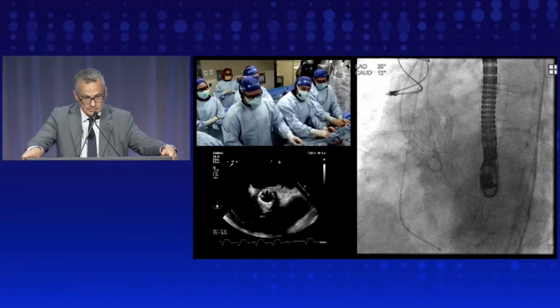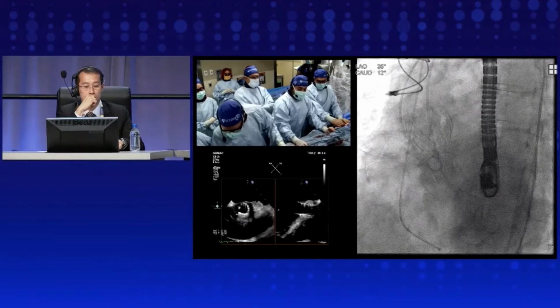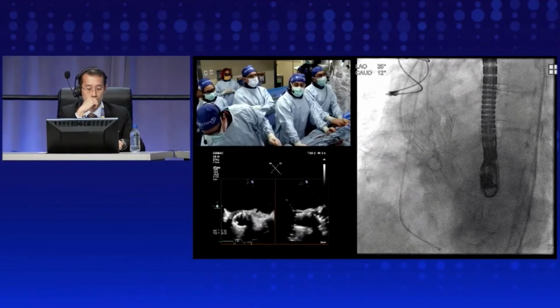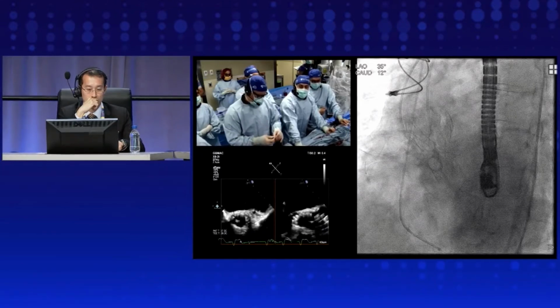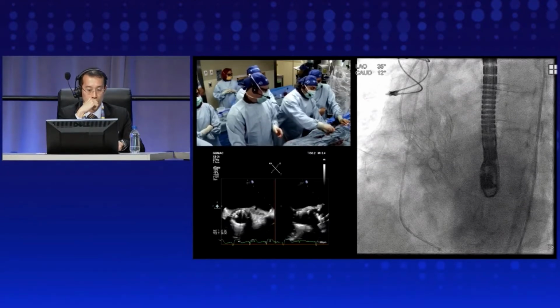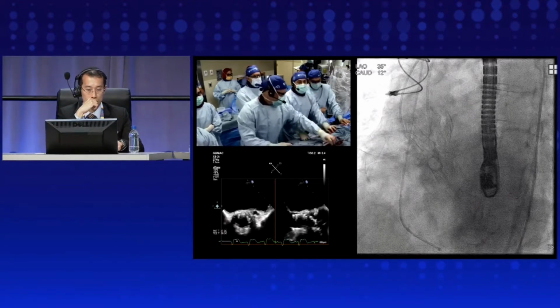How much tactile? I would say that it has to do with how well the electrical cutting is working. Every once in a while, you do not want to pull too strongly. If you do the process correctly, then the pull should be gentle. It's supposed to be slightly more than creating contact. You need to enable the electricity to do the burn on the leaflet.